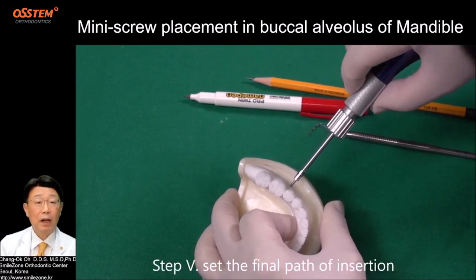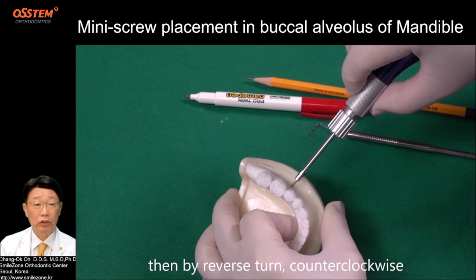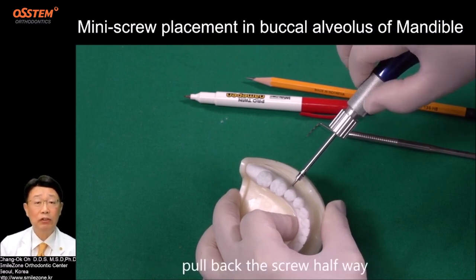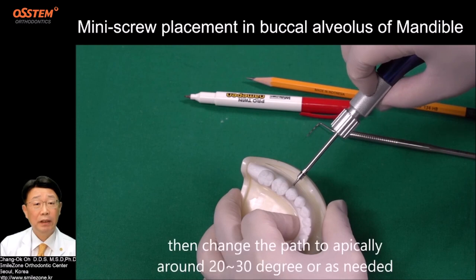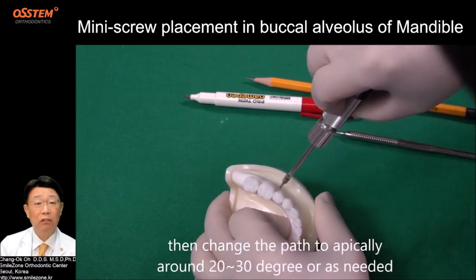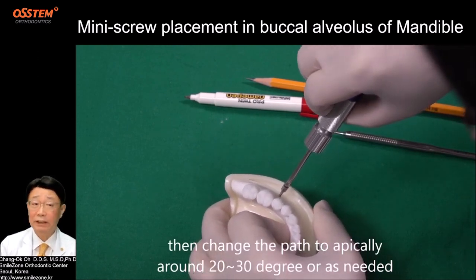Step 5: Set the final path of insertion. By reverse turn — counterclockwise — pull back the screw halfway. Then change the path apically around 20 to 30 degrees, or as needed.